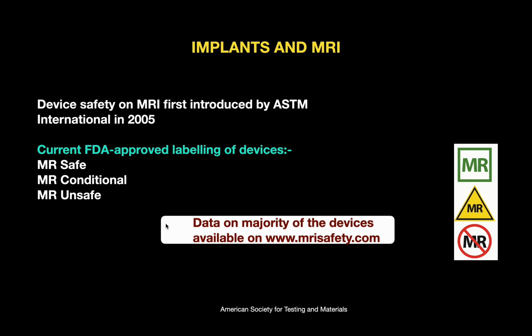And data on the majority of the devices are available on www.mrisafety.com. So here we can check the information labeled on the packet of the implants, and we can see whether it is MR safe, conditional, or unsafe.